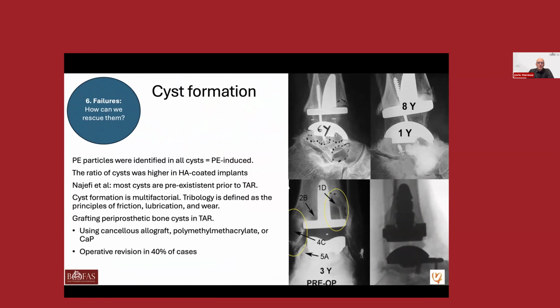So cyst formations are already addressed. Be aware that you always need to determine if the cysts are caused by osteolysis and therefore also already loosening, because most of the time also PE particles are identified in the cysts.